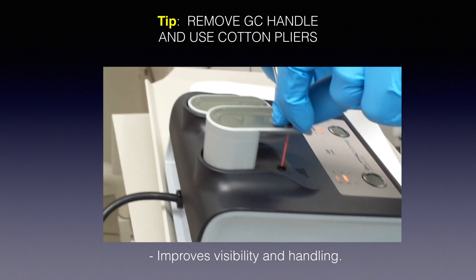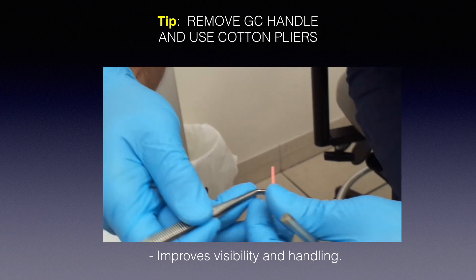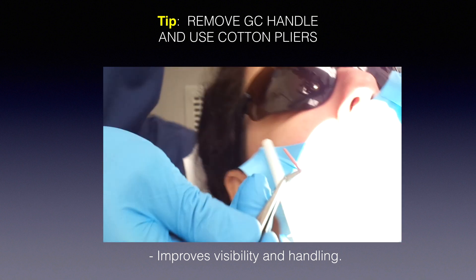I want to highlight the handle-removal feature again because I love it. Once the Gutta-Core comes out of the oven, remove the handle and use cotton pliers. Look at the built-in markers on the carrier and break it off at the correct length — really simple. Removing the handle gives you far better maneuverability. Imagine trying to fit a paper point into a posterior premolar or molar using your fingers — it won't happen. Cotton pliers are essential, and once the handle is off, your visibility into the pulp chamber and canals is dramatically improved.